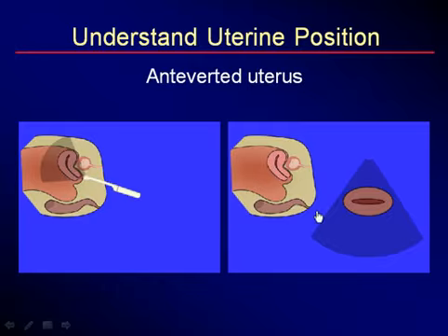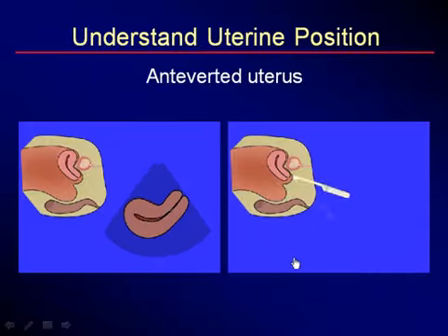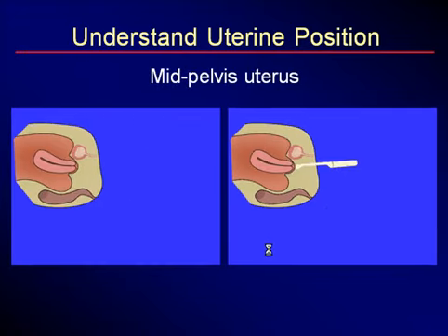We know that the fundus is pointing towards the anterior of the patient's body, but the anterior anatomic wall is here. Notice that the anterior wall closest to the beam is on the upside of the picture, right? The beam hits the anterior wall first. Anterior wall is closest to the origin of the beam. The uterus has somewhat of a donut shape, has an endometrium located centrally.